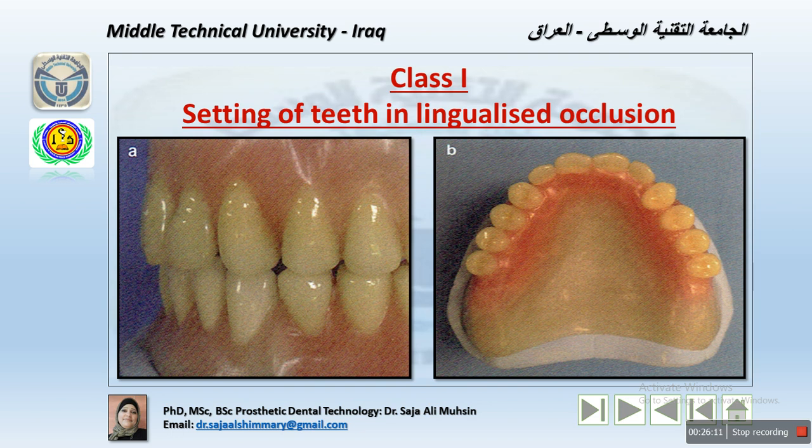Now, the lower anterior teeth are positioned according to the lower ridge, and upper anterior teeth function should normally be given preference over aesthetic. Therefore, accommodation may need to be made when placing the lower teeth to maintain denture stability.